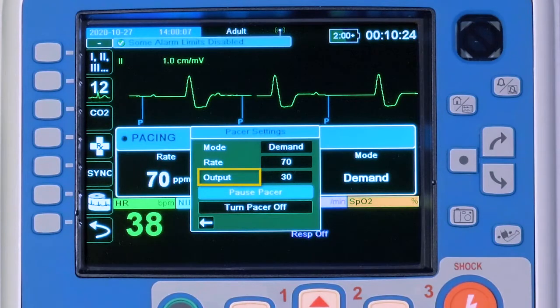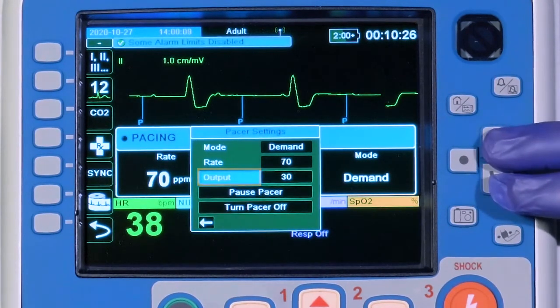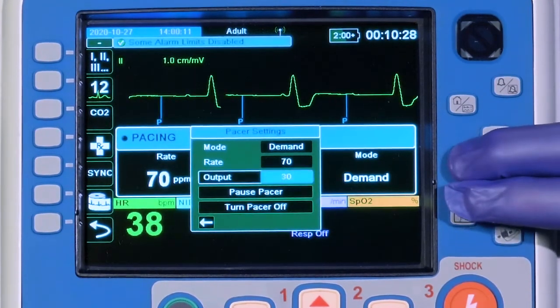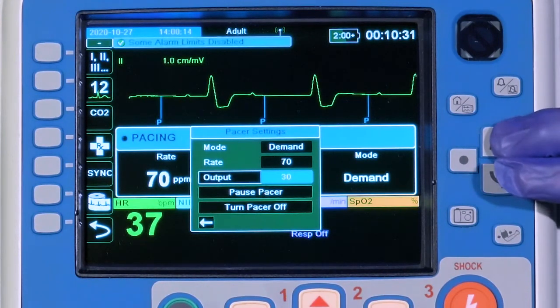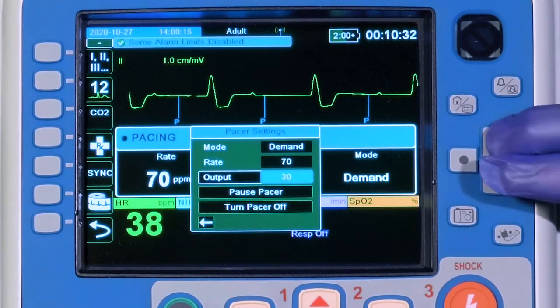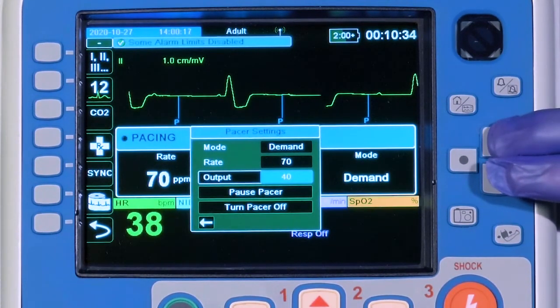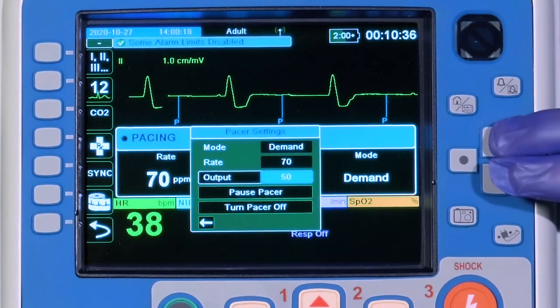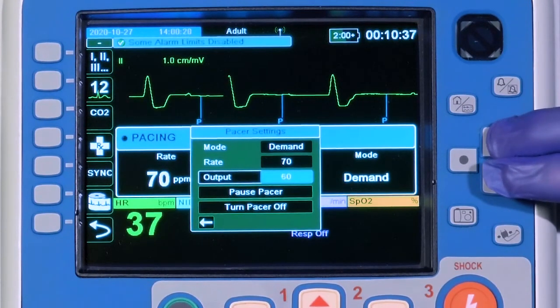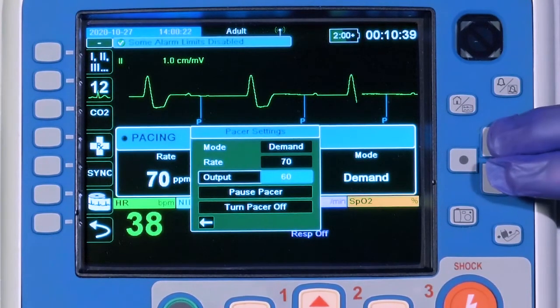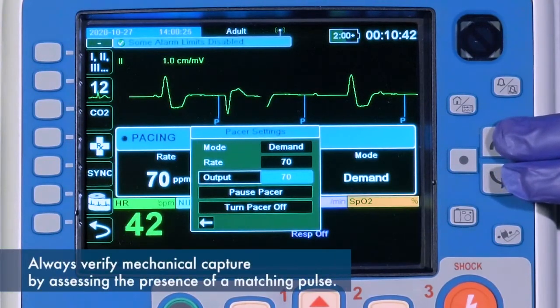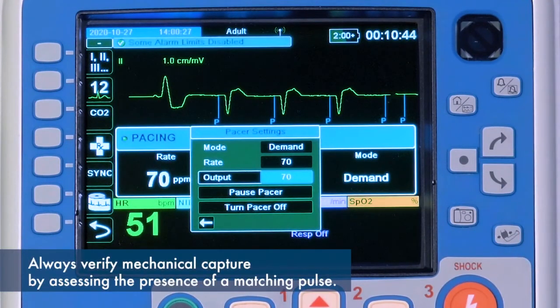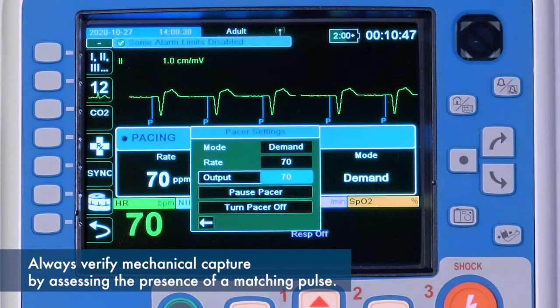Navigate to Output using the navigation keys to adjust the output. The output increases in increments of 10 milliamps and decreases in increments of 5 milliamps. Adjust the output in an upward manner until electrical capture is achieved. Always verify mechanical capture by assessing the presence of a matching pulse.